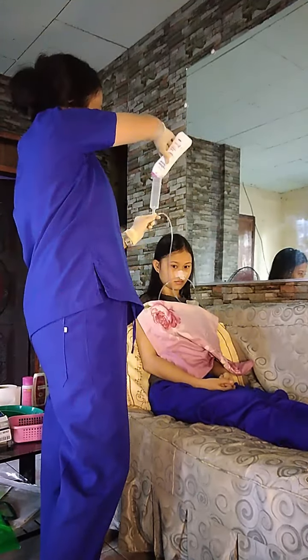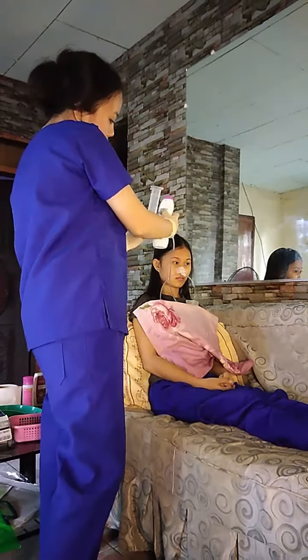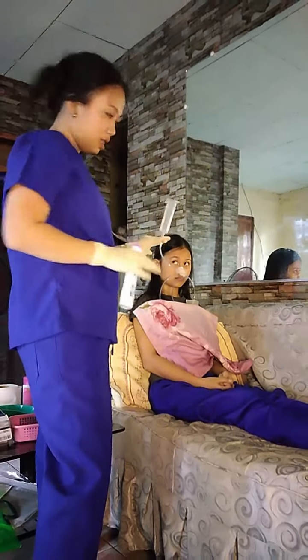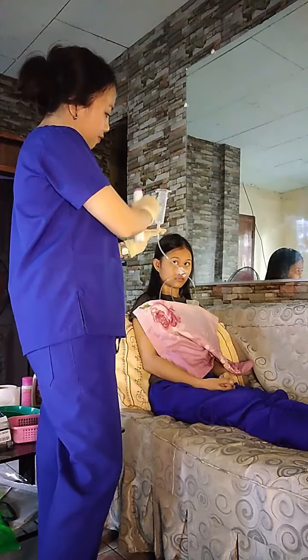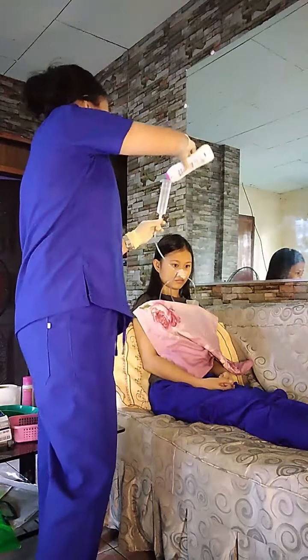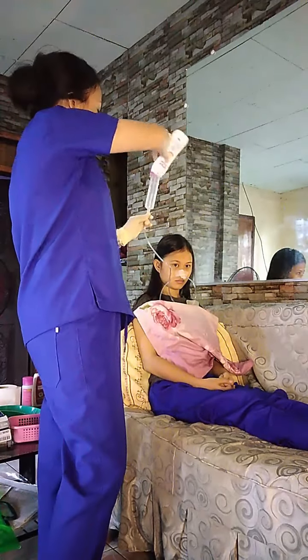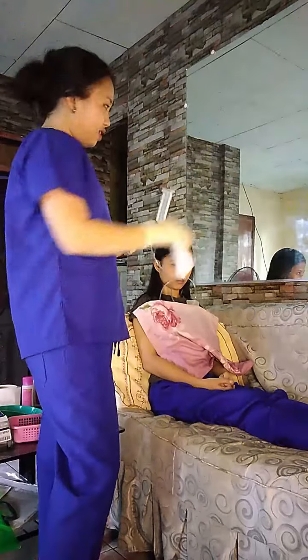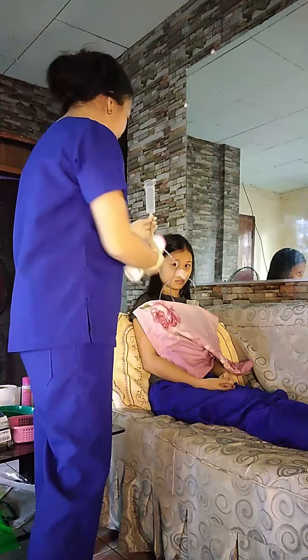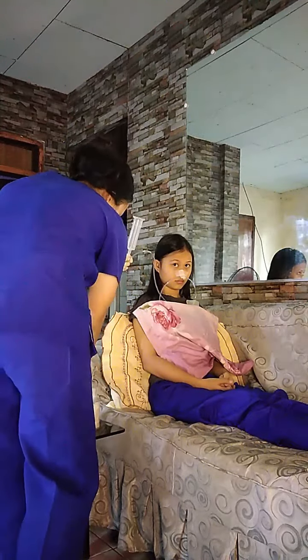So, ayan, lagyan ko muna siya ng 60 cc. And then, unkink, let the feed flow. Make sure na hindi siya nadidrain para walang air. So, ayan, continue lang hanggang sa maubos yung 250 ml na order ng physician. So, I will be kinking it again kung assuming naubos na.